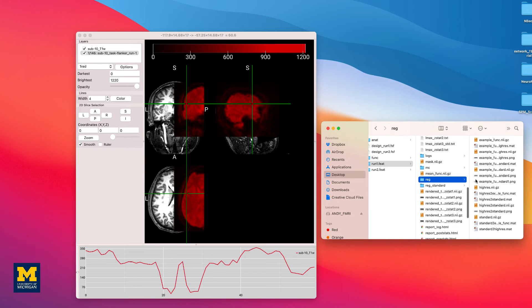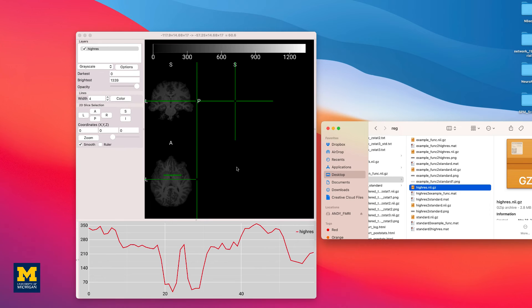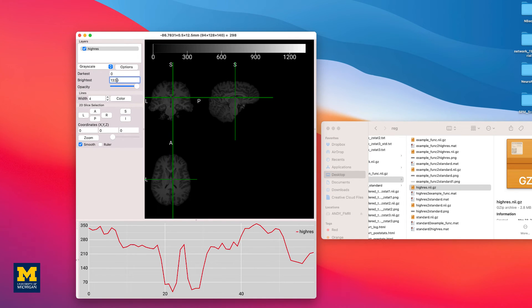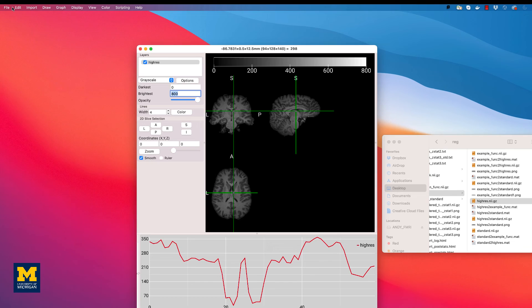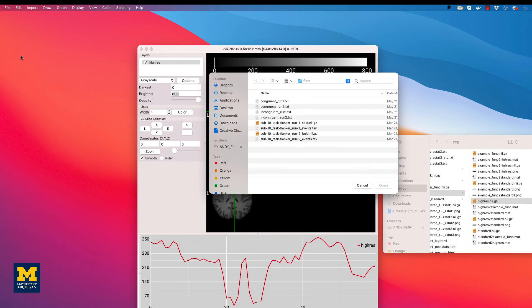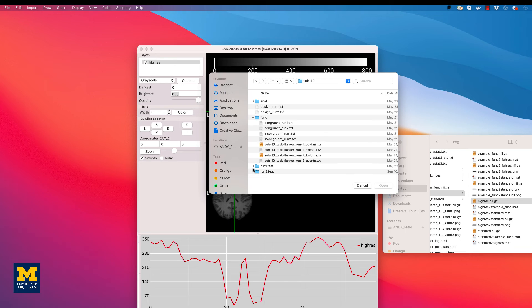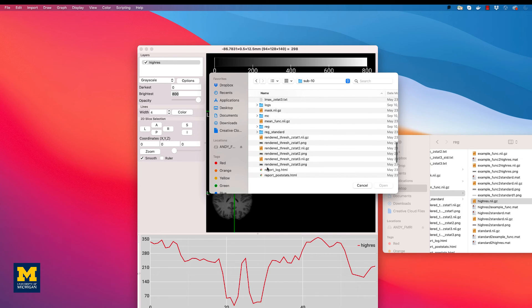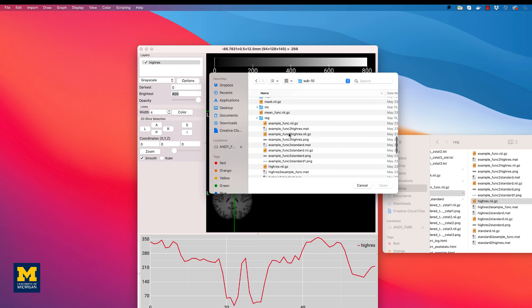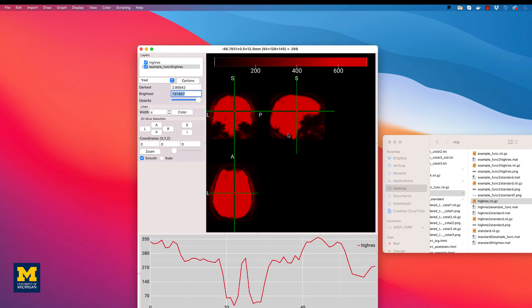Open the high-res.nii.gz image from sub-10's run1 feat directory. Once you click and drag it into the GUI, lower the value of the brightest field to 800 to better see the contrast between the tissue types. Then, click on File, Add Overlay, and select the image example_func2highres.nii.gz, which you can also find in the run1 feat reg directory. Once you load it, you should see something like this. Now, there is nearly complete overlap of the functional image on top of the anatomical image, which is what we would expect if the co-registration was successful.